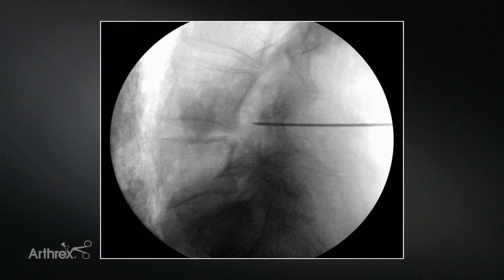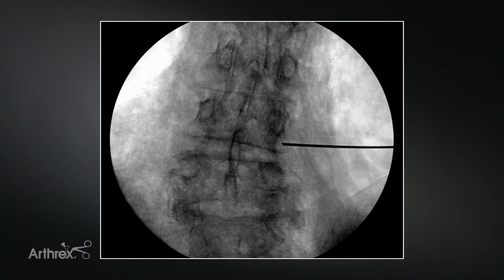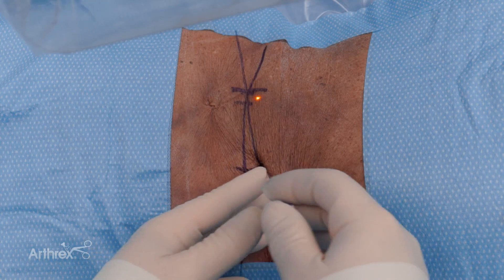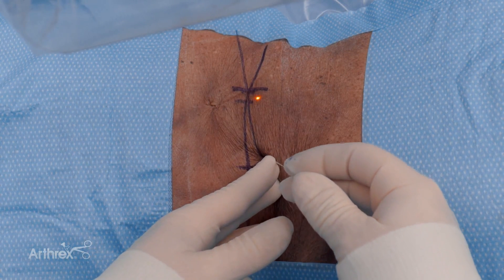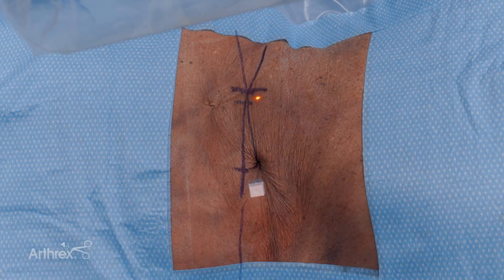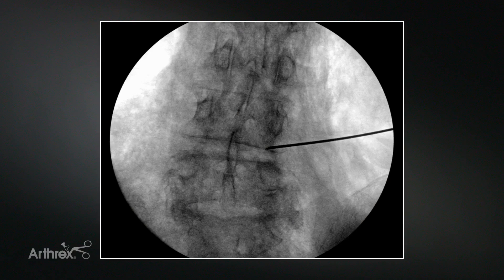I'm just at the ventral portion of the superior articular process. Now we're going to check back to AP and see how medial we are. You see that cranial-caudal trajectory we chose puts us closer to the pars, which allows us to enter the canal more medially and not be pushed out by the lateral aspect of the superior articular process. We're going to go a little bit more inferior and advance — that's a good spot, just about the medial pedicular line at the top of the disc space.